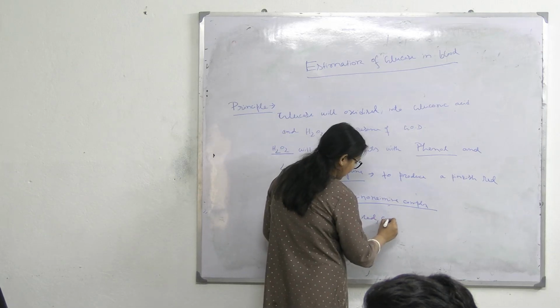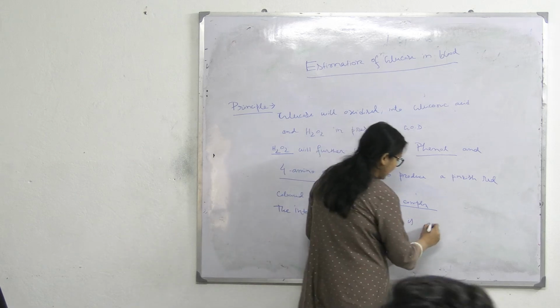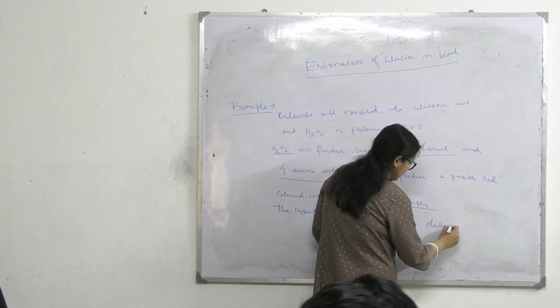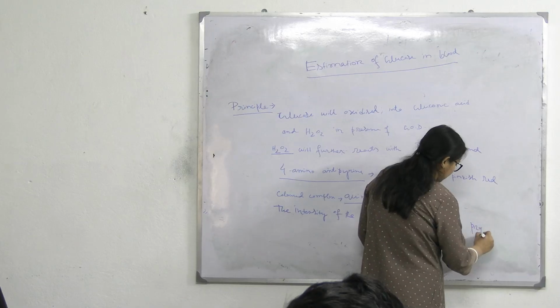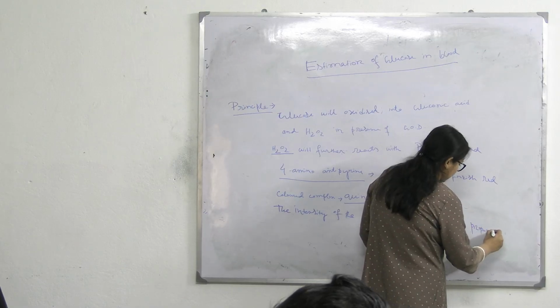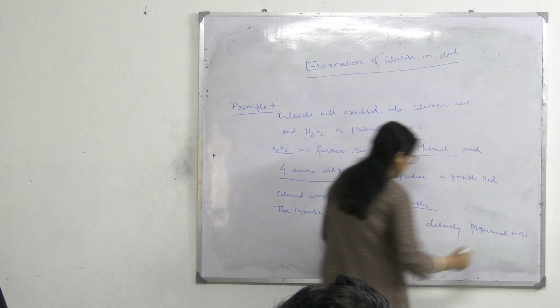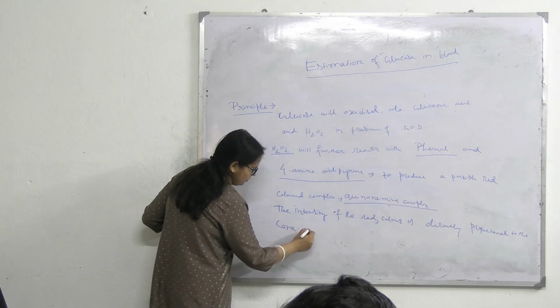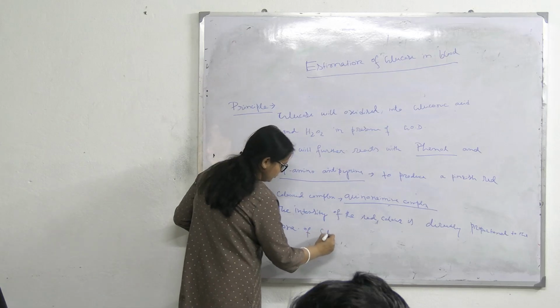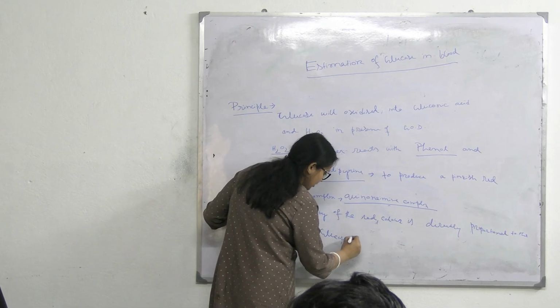Intensity of the red color is directly proportional to the concentration of glucose present in sample.